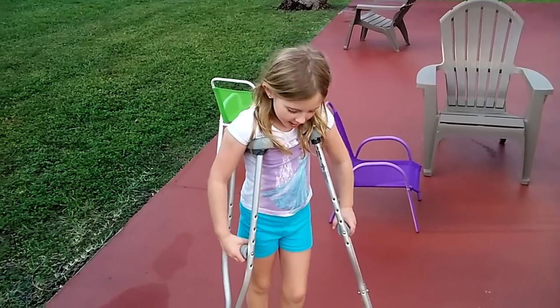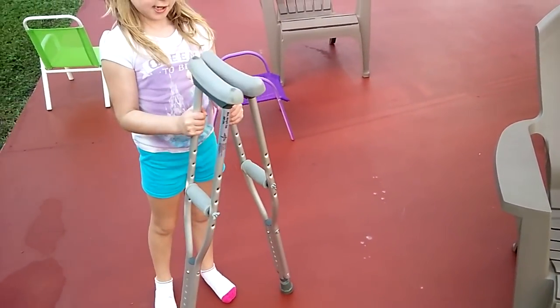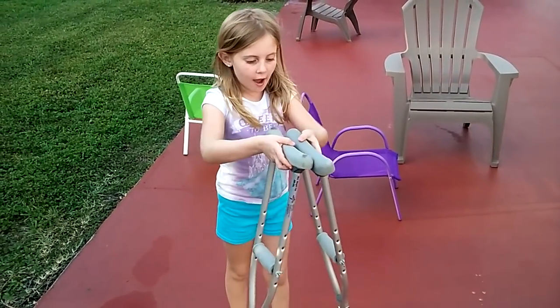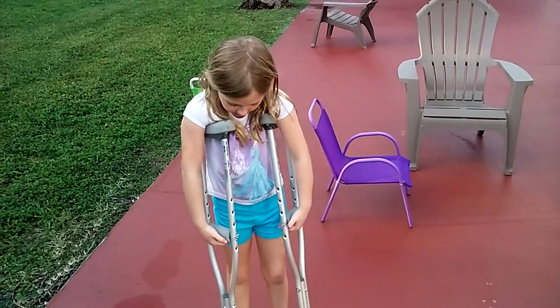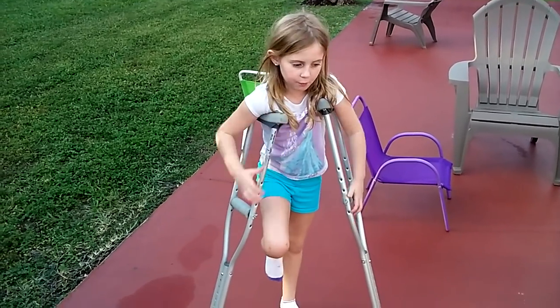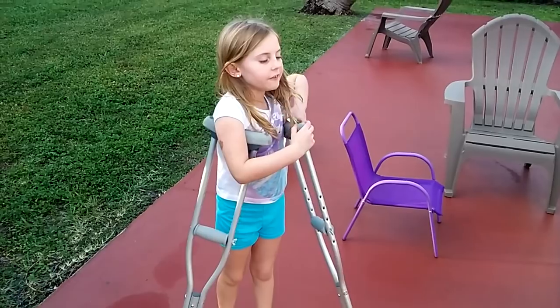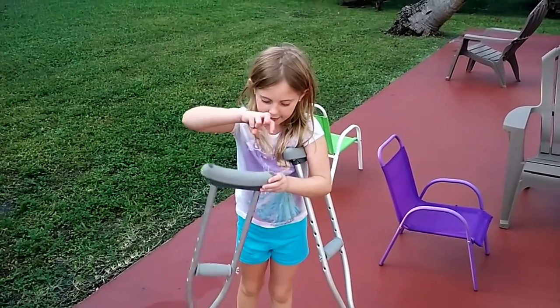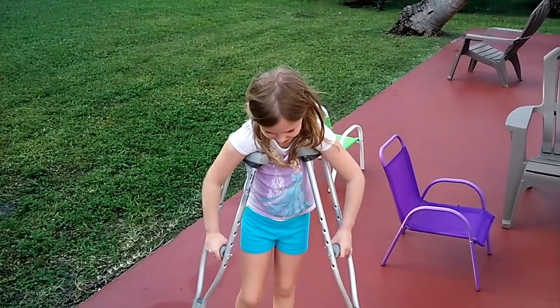How do you walk with them? Can you show them how you walk with them, what you have to do? So basically, these are my sizes, and you have to make sure they are the same size. And then you are going to put them over your arm like this, and then hold these. And then whatever foot you are injured with, you put it up. And then with the good foot, you are supposed to have three fingers right here where your arm should be. So three fingers, that is where my arm should be, like that.